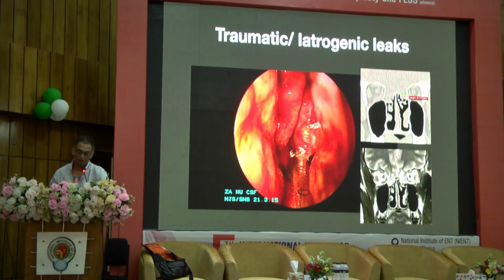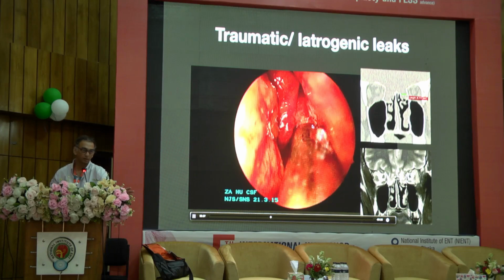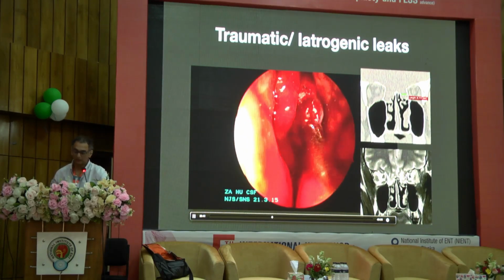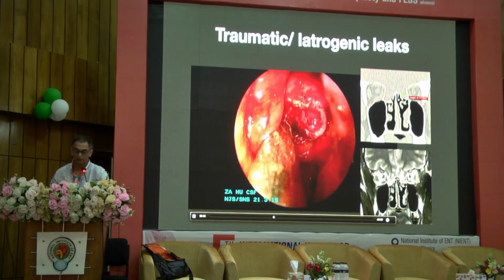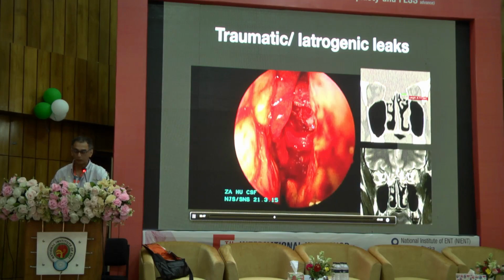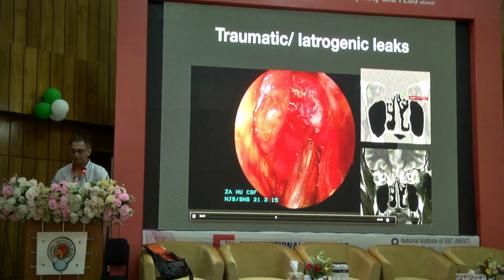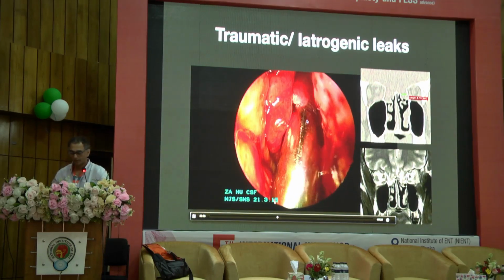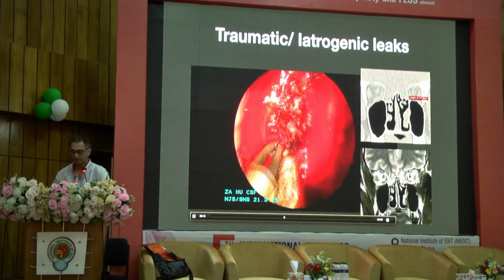This brain is dead brain. It's not functional brain. I have a neurosurgeon with me in the theater whom I'm always talking to. Is this okay? Not okay? What am I doing? It's crazy what I'm doing, but am I okay to do it? So we're going to debride it, and then in between we keep bipolaring to see if now it's soft and will it shrink till it goes high enough towards the skull base, and then the last part we can bipolar.